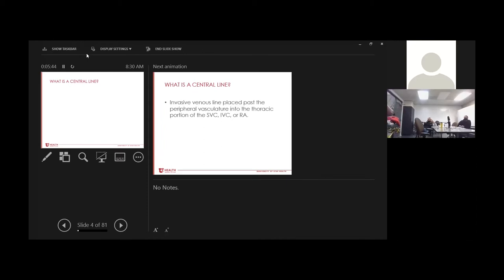So let's start from the basics. What is a central line? And I'm just as informal, but I am going to be calling on you guys because I think that makes this go a lot more fun. So Ron, what is a central line in your eyes? It's a catheter placed into a large vessel.